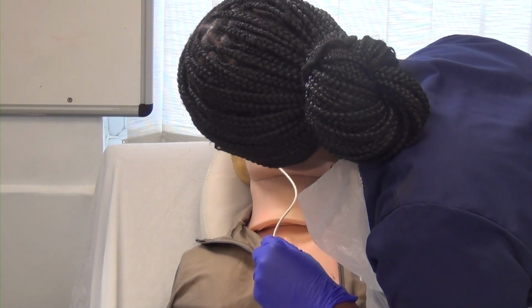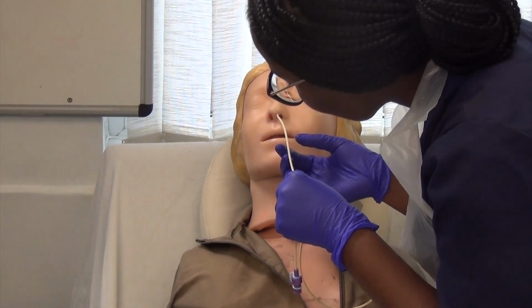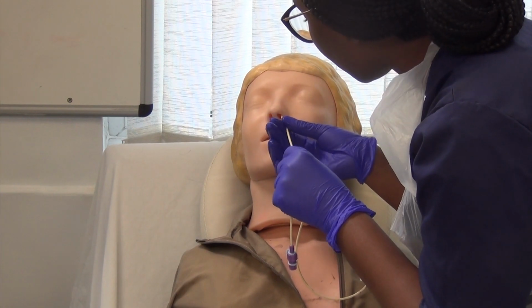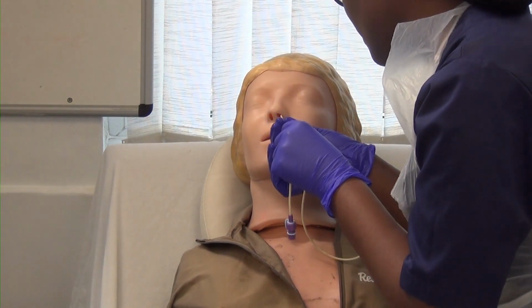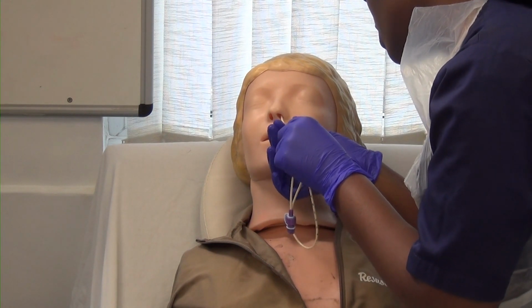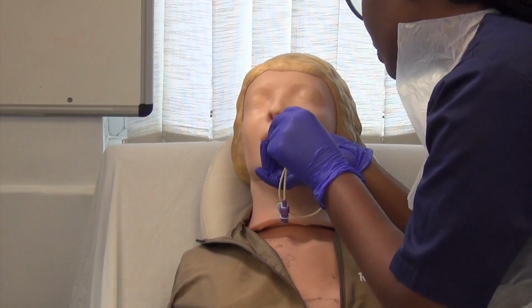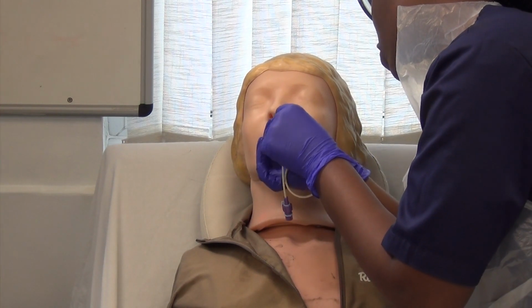And I want you to keep swallowing. Is that okay? Yeah. Okay, and I can see there is no coiling in the mouth. All right, I'll keep inserting backward, going in. I do not feel any resistance, and I can see no coiling in the mouth. Okay, I can see Sue is not in any form of distress. The tube is not coiling in the mouth as well. And I keep going till we get to the next measurement.